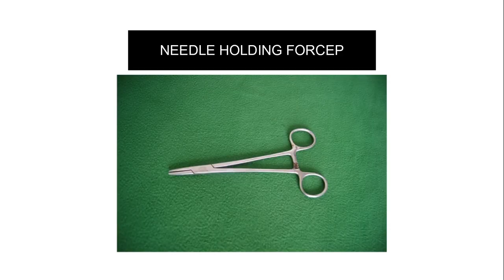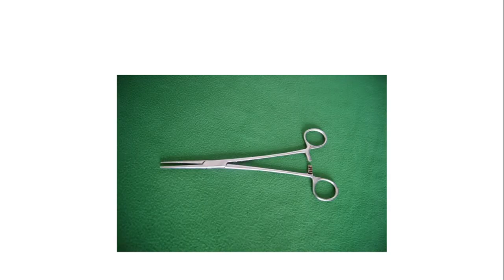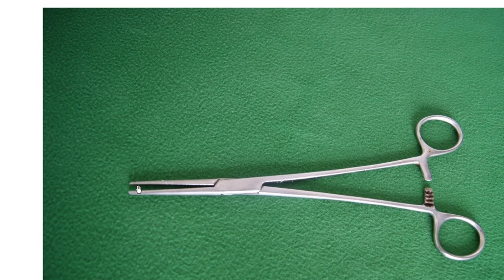This is the needle-holding forceps. You should differentiate it from the artery forceps. The main difference is: when you look at the needle-holding forceps, you can see cross-striations — the lines are in a cross pattern. When you look at the artery forceps, you can see straight striations — the lines run straight. This is the straight artery forceps; if you look here you can see straight lines.